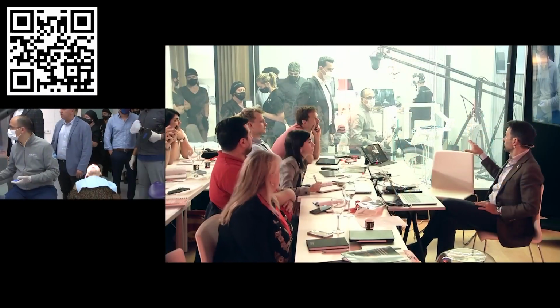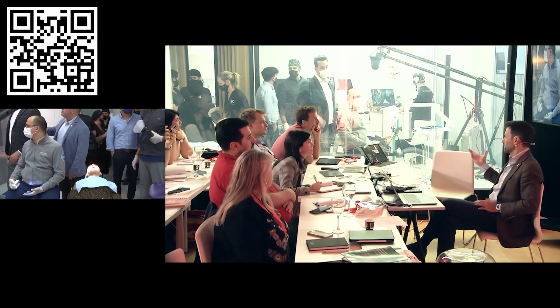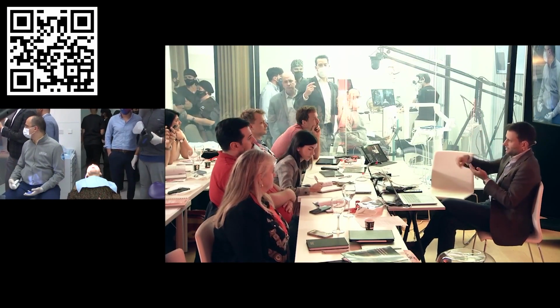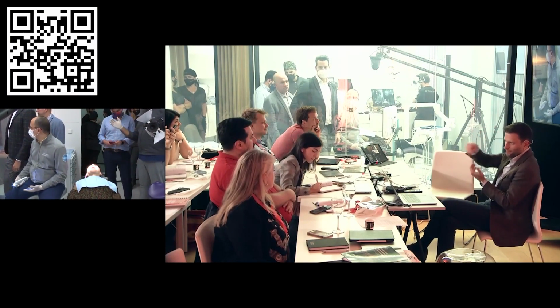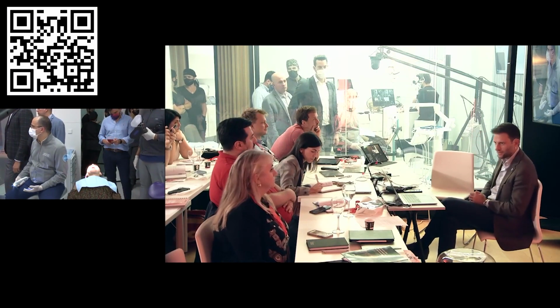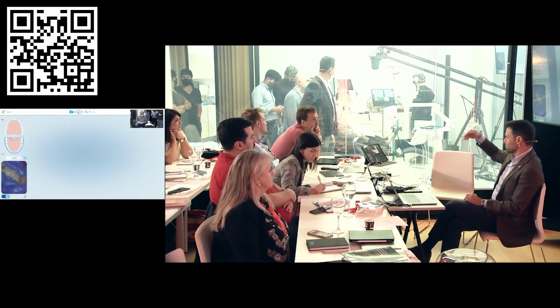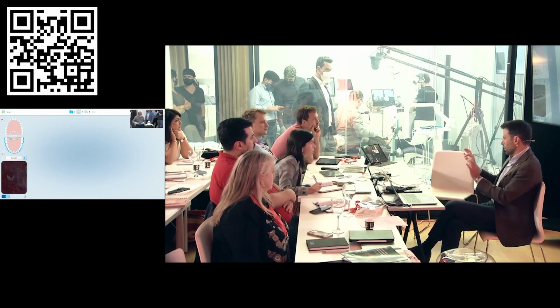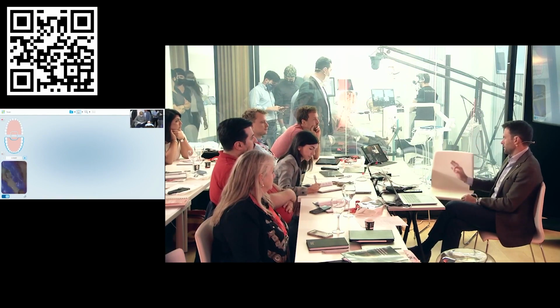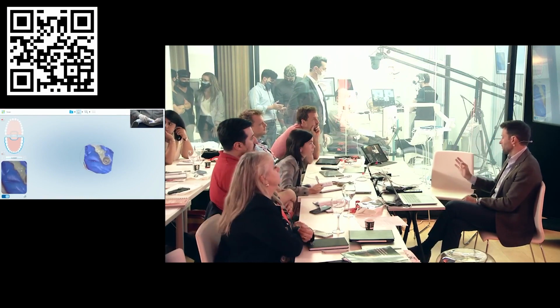So you don't want to cut and join. You're just going to pretend. Imagine that we did it in the mouth. That we cut it and we... You understand the story? We're not going to cut and put acrylic again. I think that step is okay, right? And so we're going to pretend that this one already has the acrylic joining. You join in the mouth like any classic high precision impression.